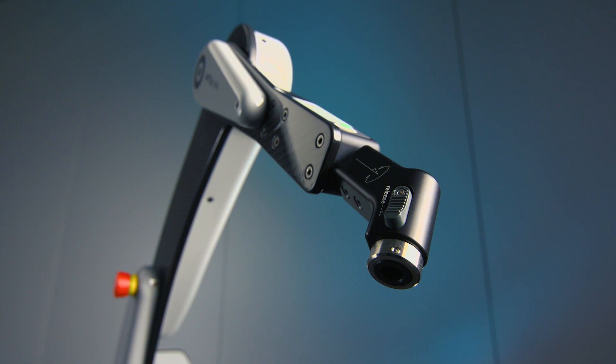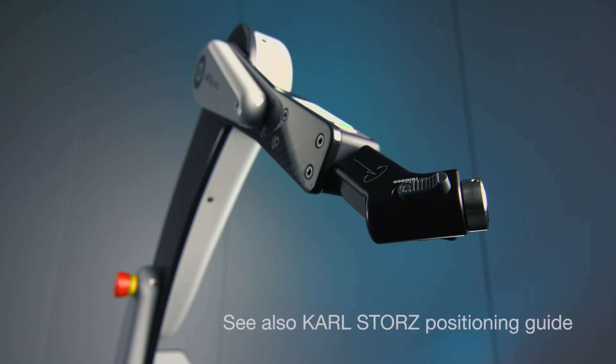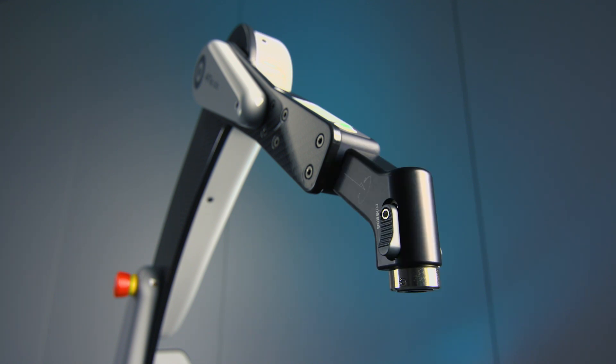To find the best position for your procedure, pull down and rotate the cantilever or swivel joint in 45 degree steps. See also the Karl Stortz positioning guide.